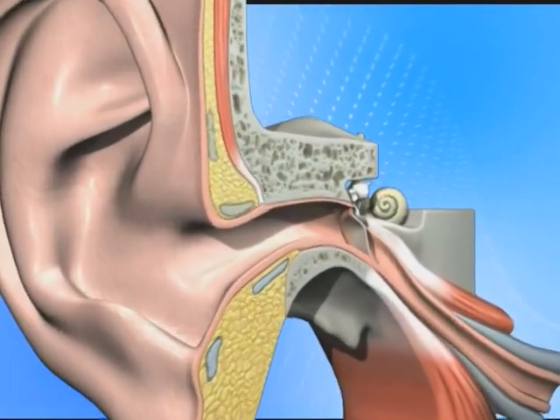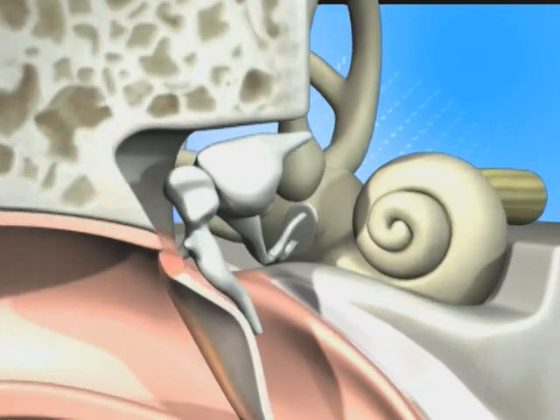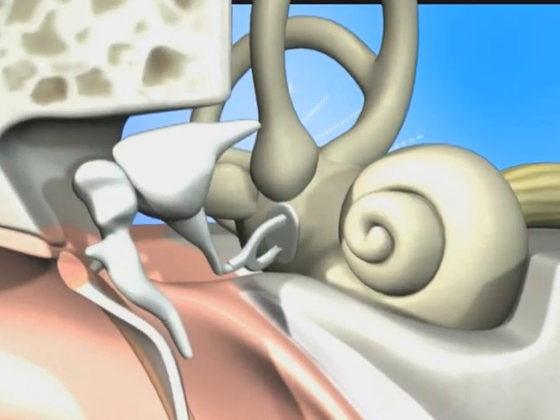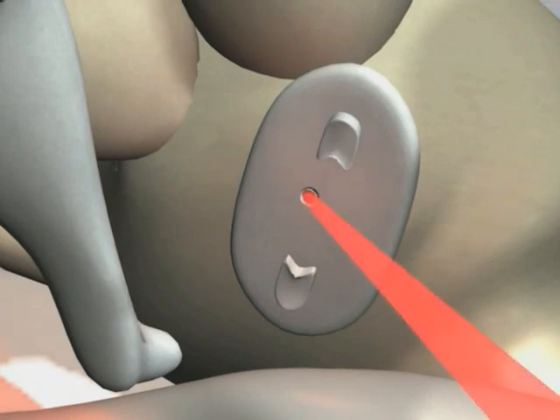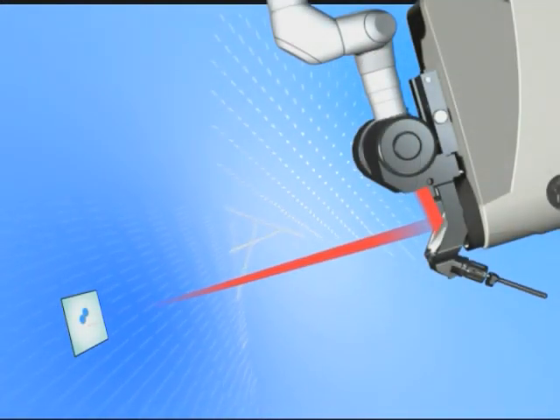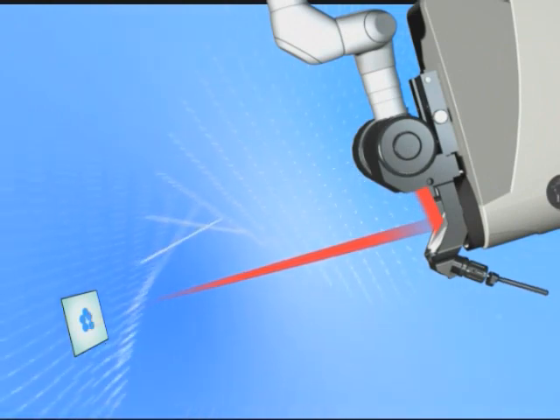Laser stapedotomy is an effective modality to treat certain forms of otosclerosis. Different approaches and techniques exist. One common approach is the rosette technique using the CO2 laser and micro manipulator, where several small laser shots are applied in a rosette pattern.